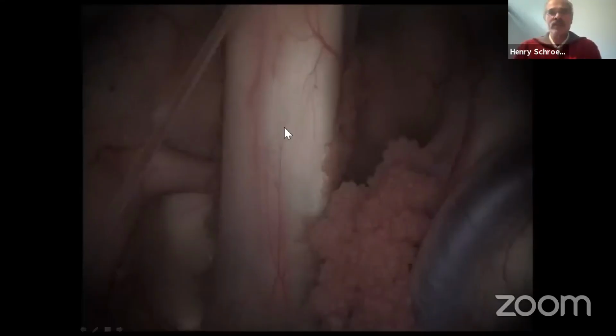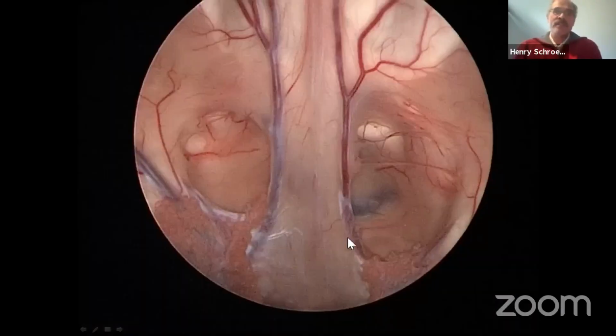That means it's just one ventricle without a septum pellucidum, and you see the fornices running free through the ventricle. And here you see the massa intermedia, the choroid plexus, and a very large thalamostriate vein. It's another case where the septum is missing and you see the fornix running here, and this is one foramen and this is the other foramen.